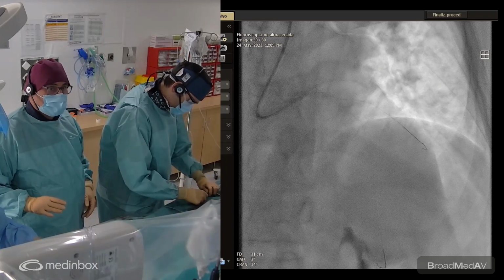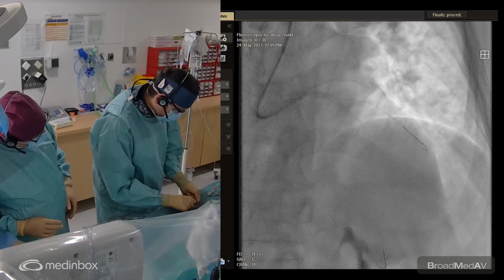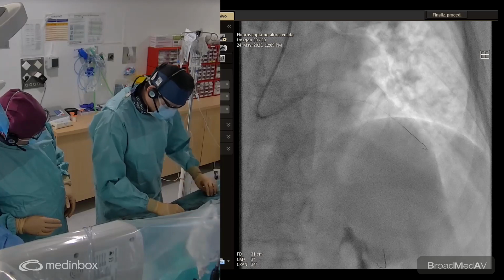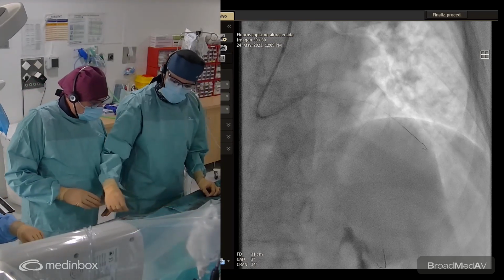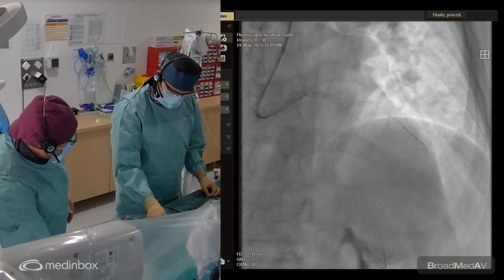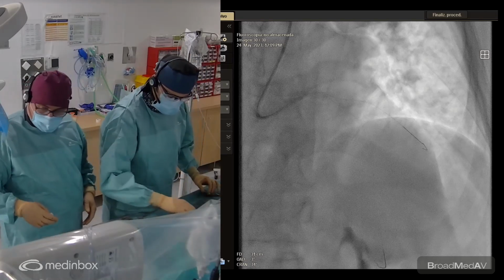One of the shockwave and all these cases of today are being done with this technology. Probably you know it, but just to recap, it's a rapid exchange balloon connected to electric energy, the generator that is there. I don't know if you can see with the cameras.